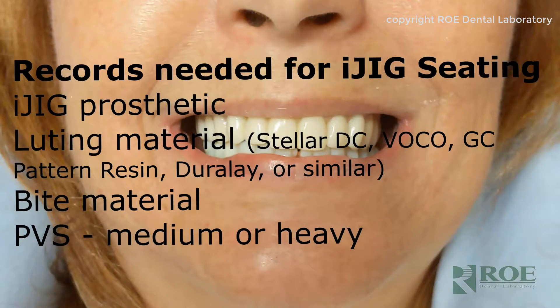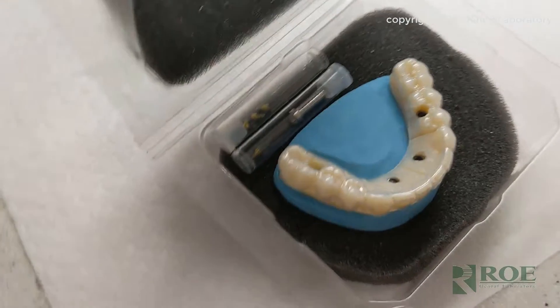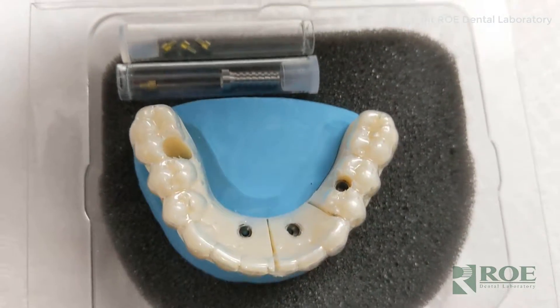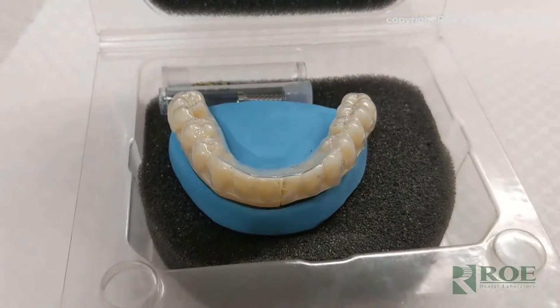Okay, let's get started. Today is an iJIG appointment, and it's not just an iJIG appointment — it's an iJIG with a site to pick up a temporary cylinder for an implant that was added after surgery.